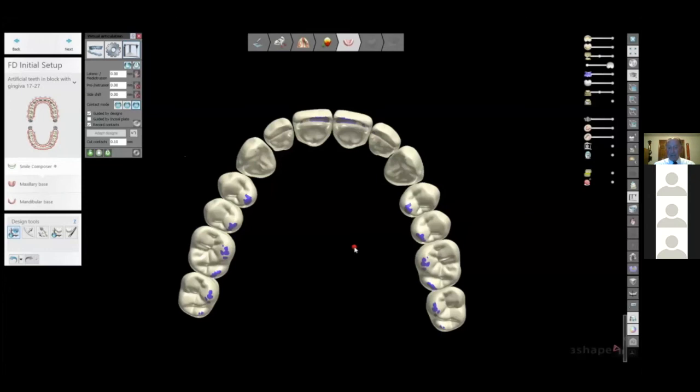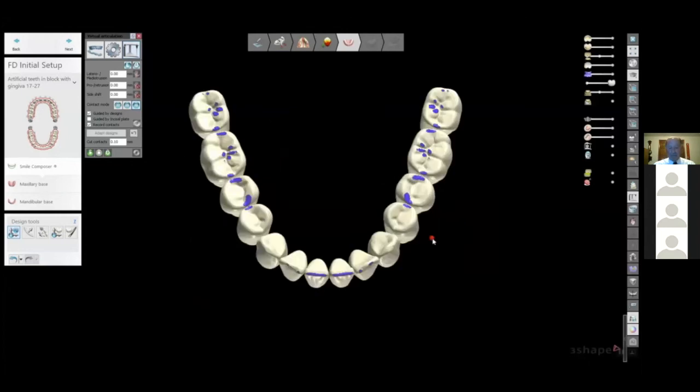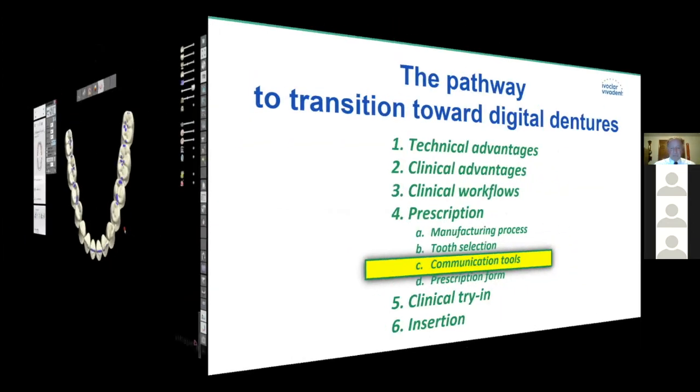So you're seeing a classic lingualized occlusion. Only palatal cusps are making contact. Freedom in excursion on the buccal cusp side, and on the mandibular arch, basically central fossa with some guiding surfaces, working and balancing. And this is unequilibrated. So it's a beautiful occlusion, a little easier to handle, easier clinically for me to do any kind of adjustment to it, very simple to understand. And now with this technology, we improved what Lee and I did, using this digital technology to really bring us forward.